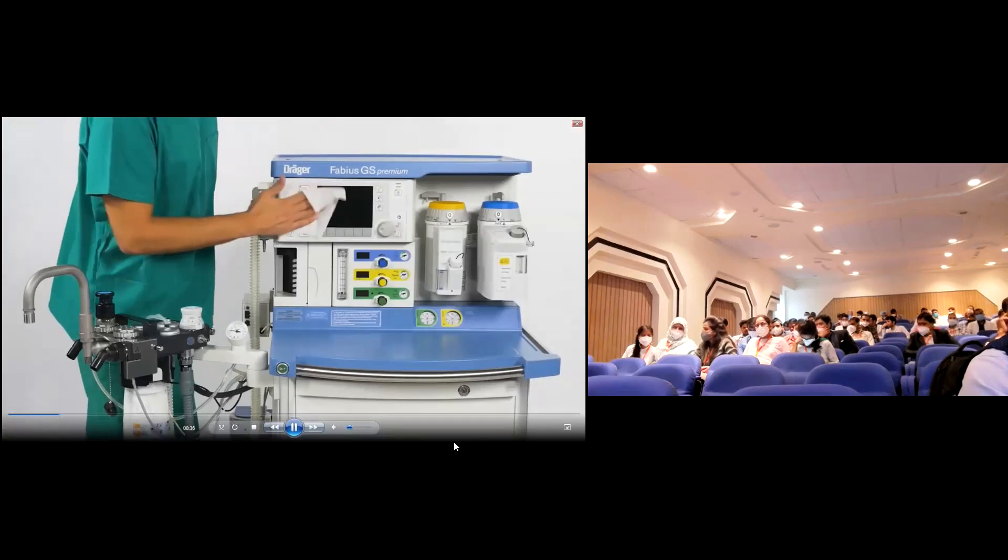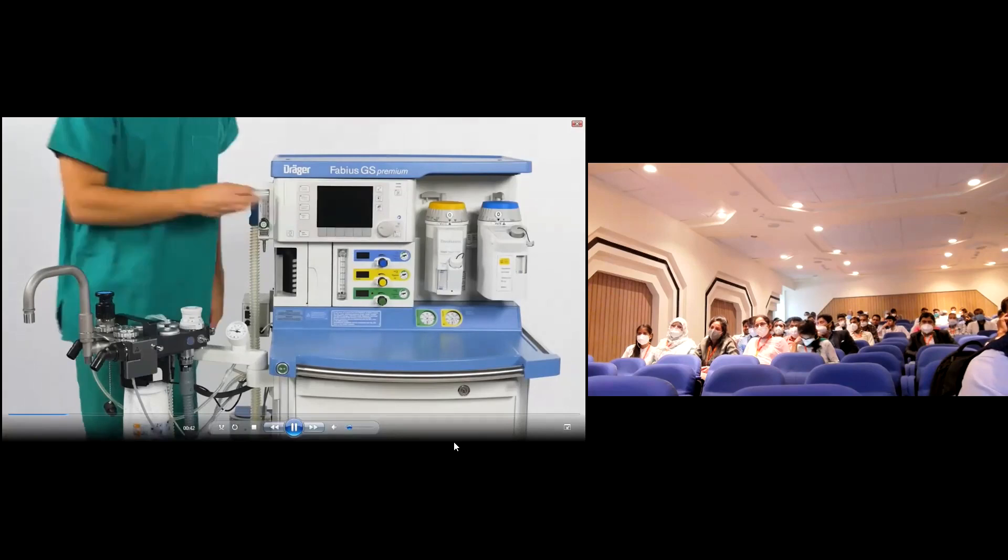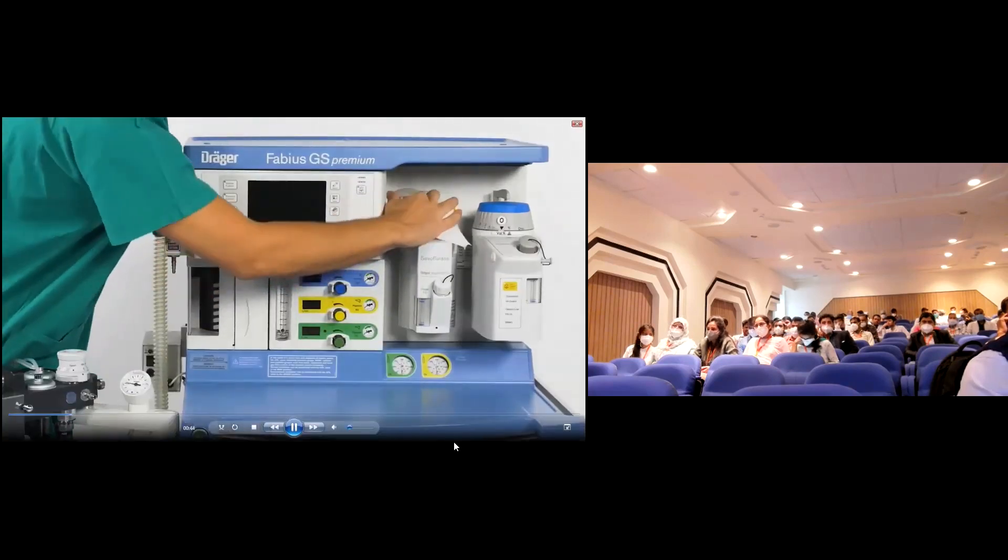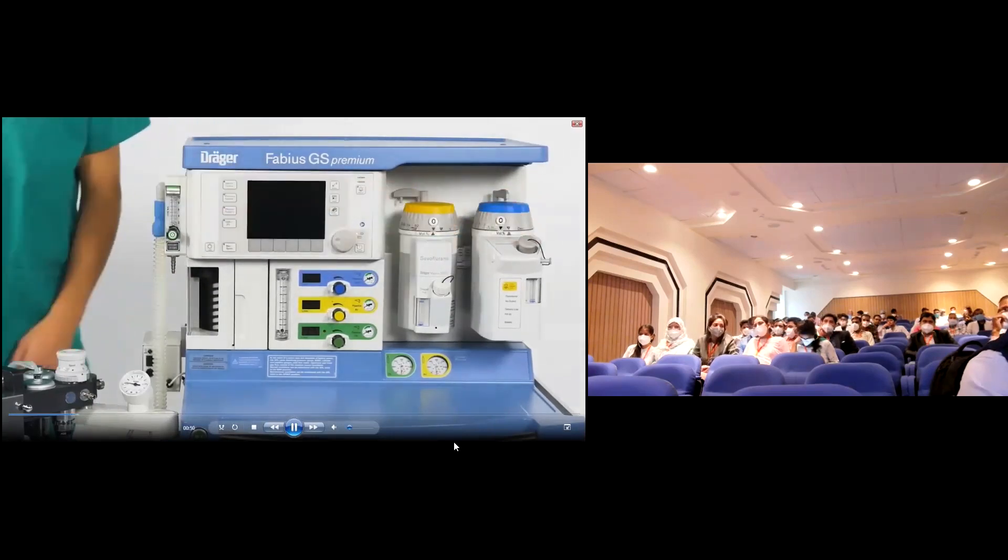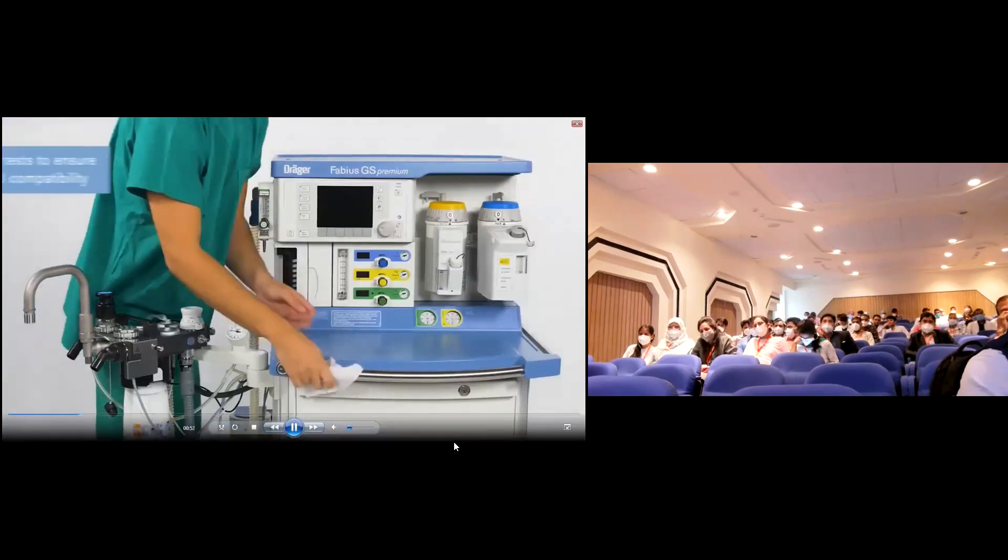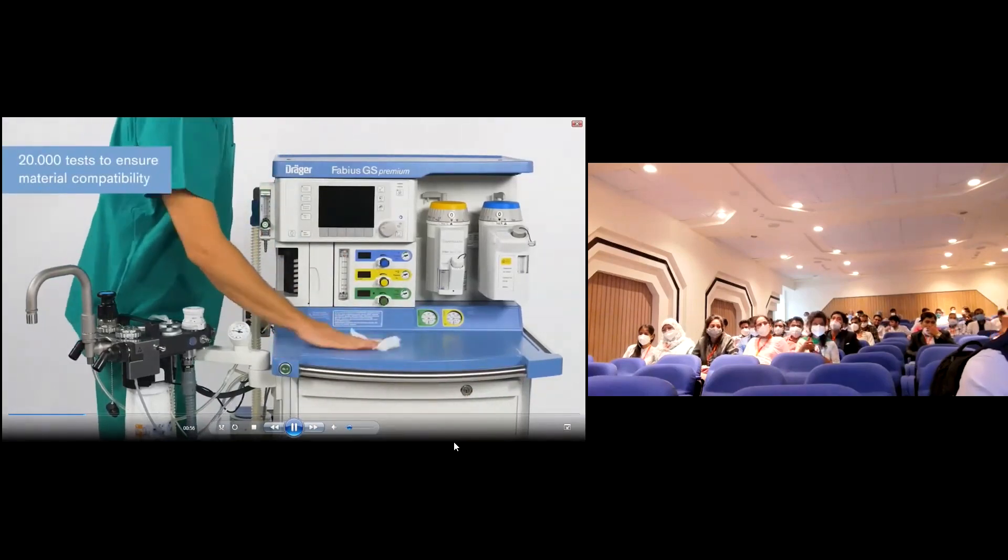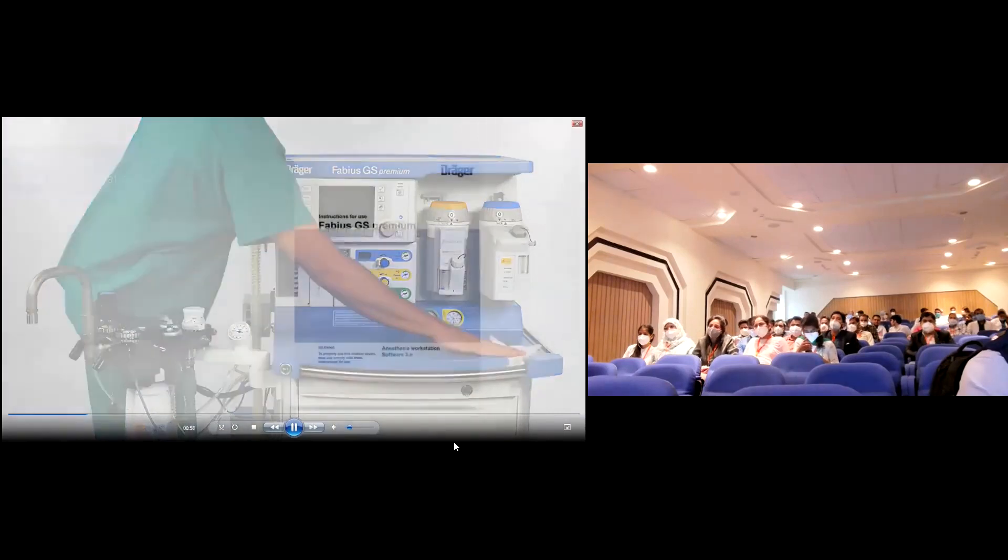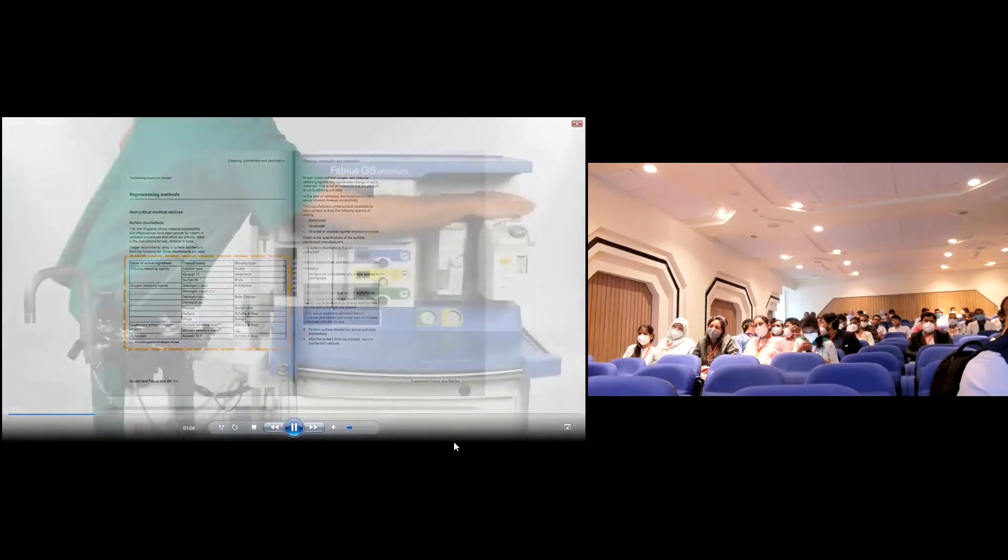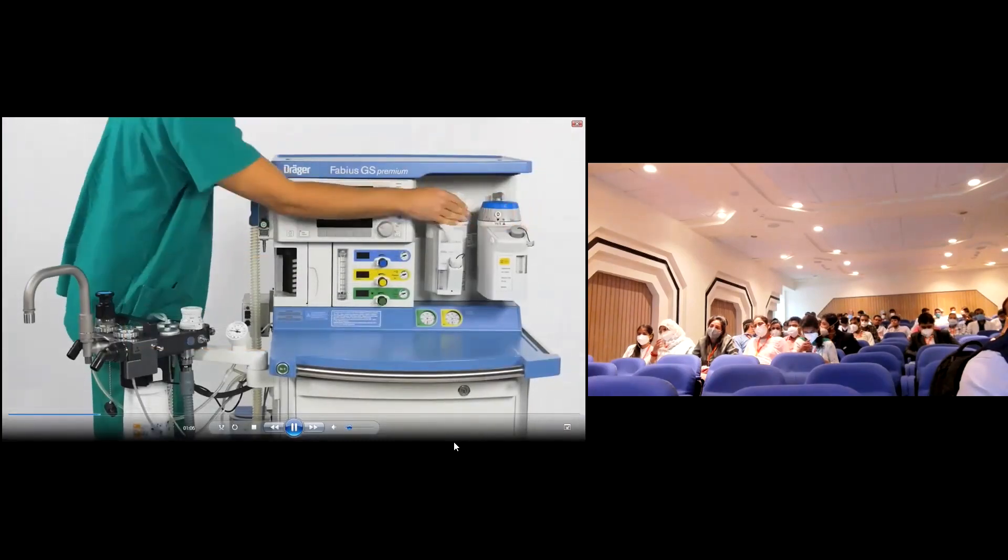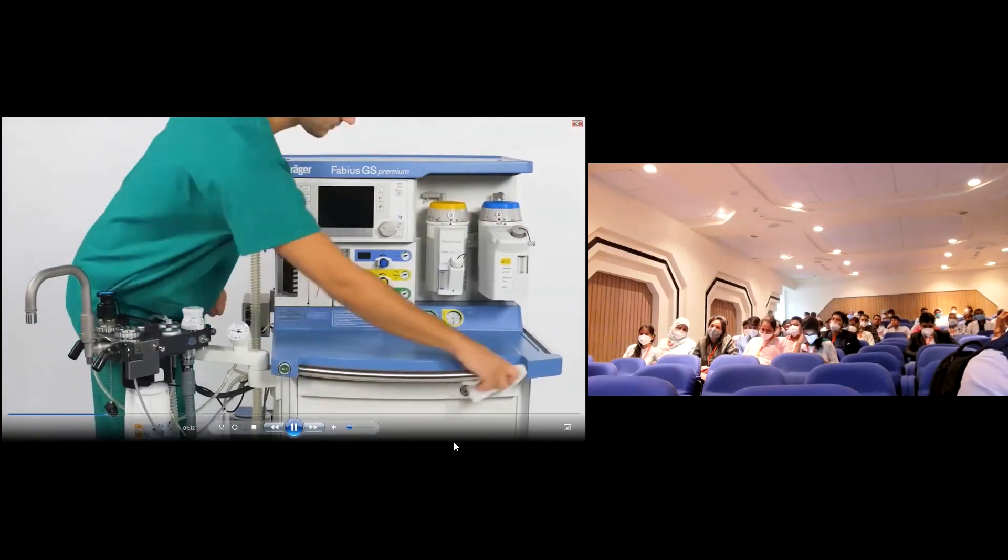We start by cleaning and disinfecting the surfaces of Fabius GS Premium which are frequently interacted with. First, remove all visible residue from the surfaces of the device. This is followed by disinfection. As there is a wide range of germicides available, we've conducted over 20,000 tests to ensure compatibility of the materials used in our products. The instructions for use of Fabius GS Premium includes a list of validated agents.